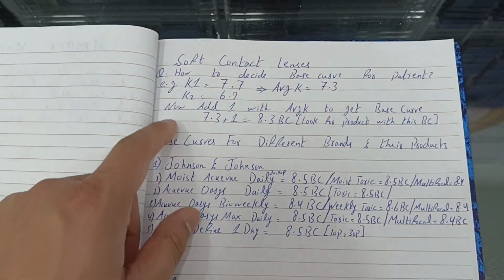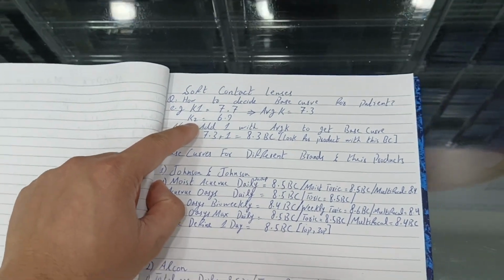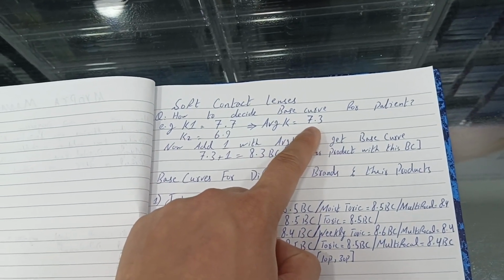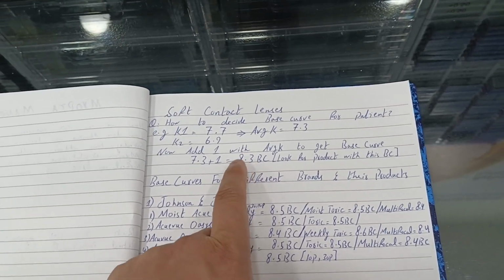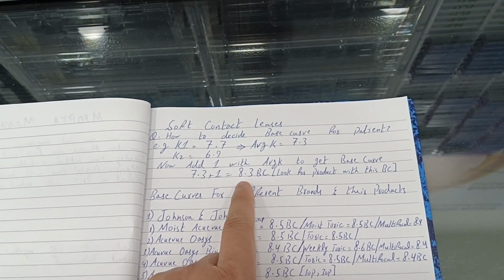So let's say for example we have a K1 reading of 7.7 mm and a K2 reading of 6.9. So we will take its average. Average is taken by adding these two and dividing by 2. It will be 7.3. So for the base curve we have to add plus 1 to this. So it will be 7.3 plus 1 equal to 8.3 base curve. So this is our second step, how we decide the base curve for the patient that we are prescribing the soft contact lenses.